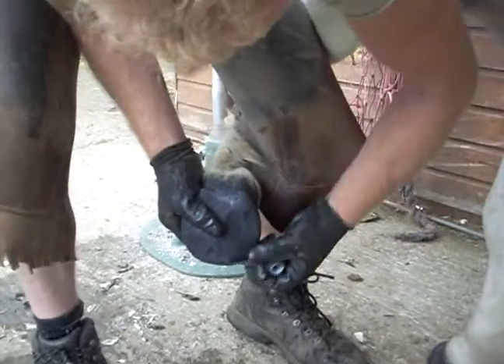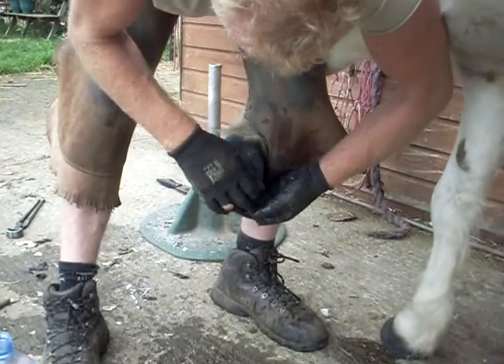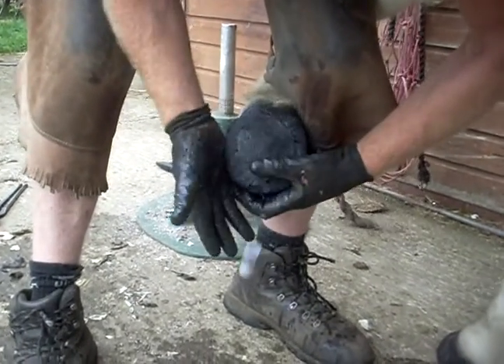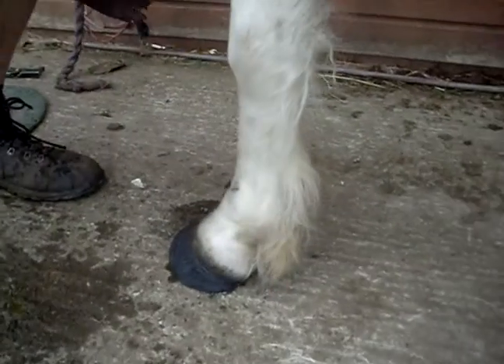Nearly at the end of this one now. I'm just going to crisscross across the sole again to make sure you've got plenty of support in that area — just at the end of the roll. Once that's on, I put the foot down and pick the other foot up to become weight-bearing.